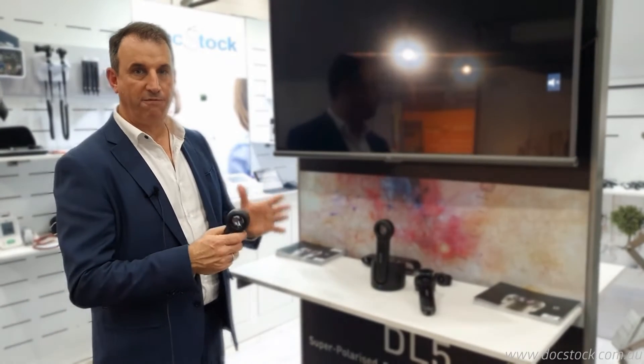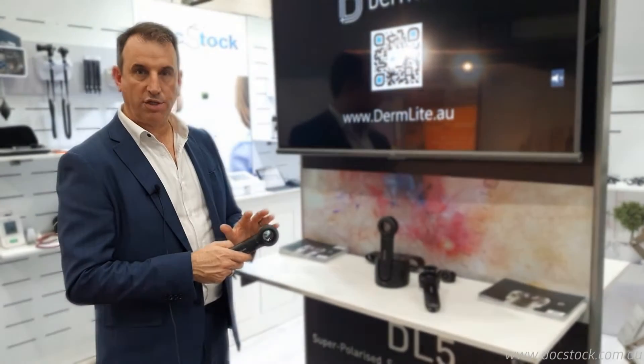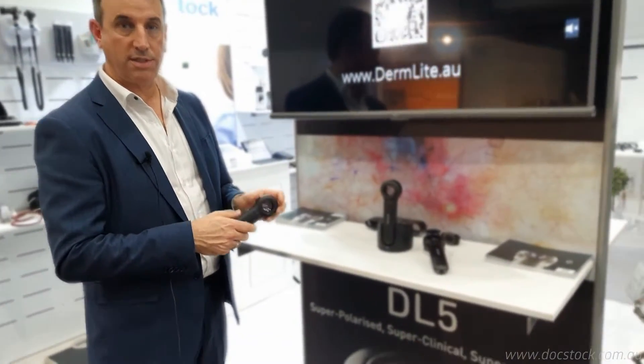So it's a really fully featured Dermatoscope. I want to now just quickly show you how to use the device so you understand the features of it.